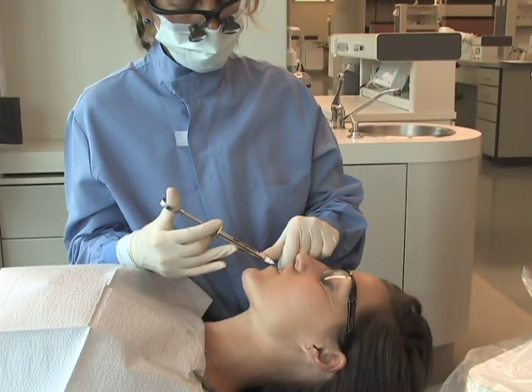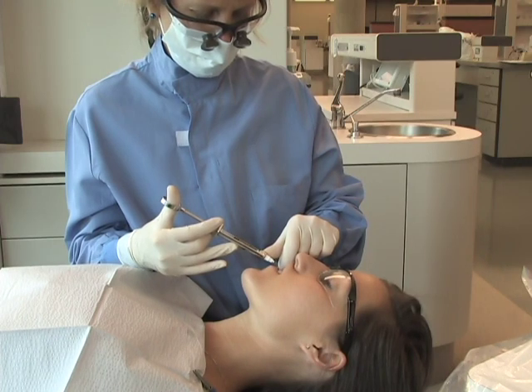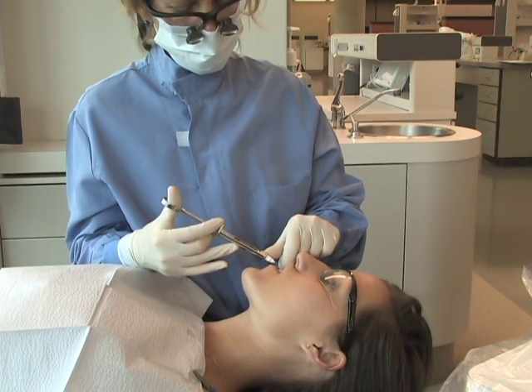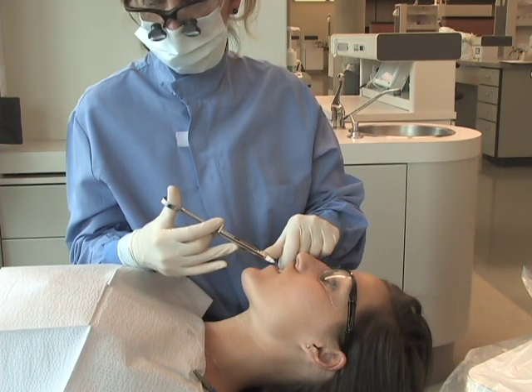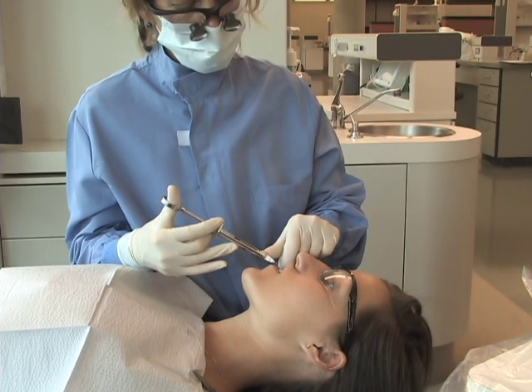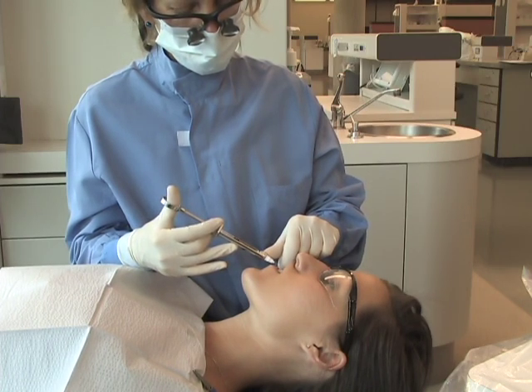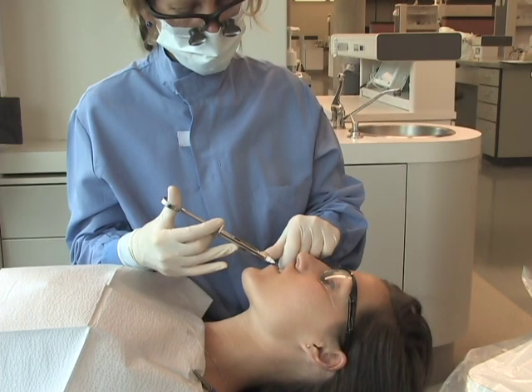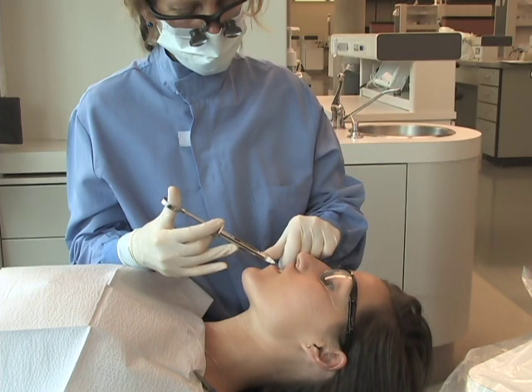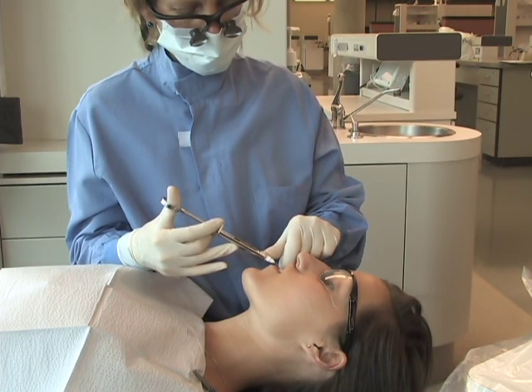The clinician must remember to communicate with the patient throughout the entire procedure. Besides maintaining supportive verbal communication, it is important to observe the patient's face and body for signs of discomfort during the procedure. Speak to the patient in a positive, reassuring manner, remembering that the patient cannot answer questions. Do not leave the patient unattended after administering local anesthesia. If an adverse reaction occurs, it will usually happen within several minutes after the injection is administered.